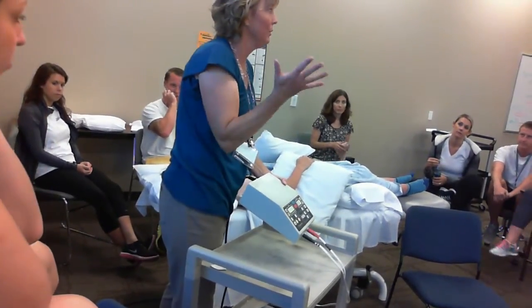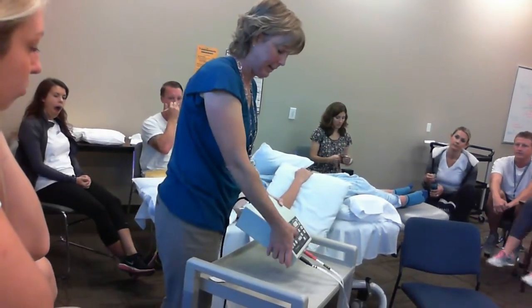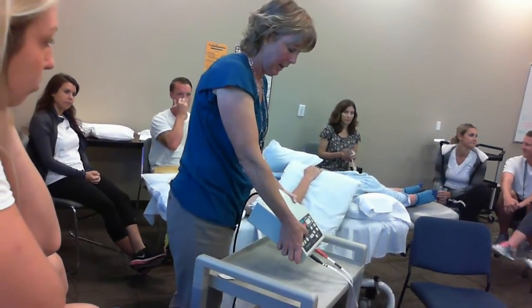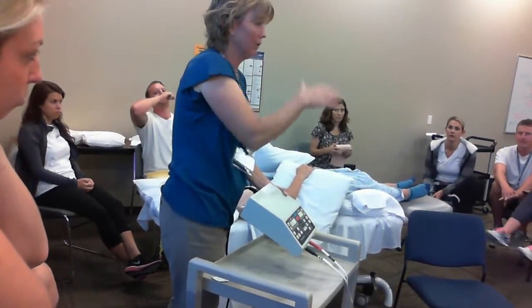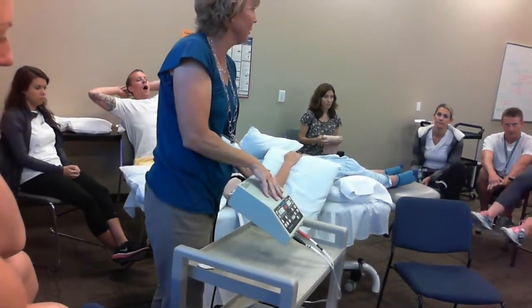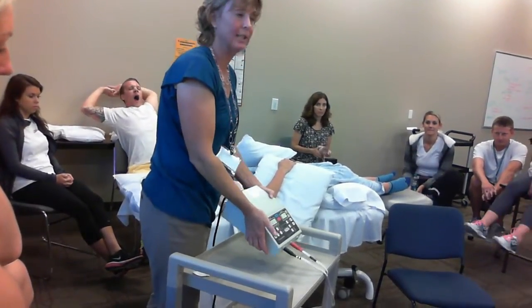What if I want to see what rate this machine is going to give that high rate at? I can hit a little toggle button up here, and it'll say 80 to 150. That falls into my range, okay? So there's a range that it's running at, somewhere between 80 and 150. It's moving around at that rate. So that's perfect, because that's just what I want.